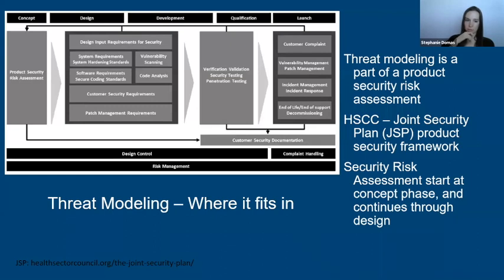So this diagram is lifted from the JSP, which was the first link on my previous slide. And so what you're seeing is it's basically laying out all the pieces that you should be doing for cybersecurity in your medical device's life cycle. And what we're going to talk about is where threat modeling fits in.